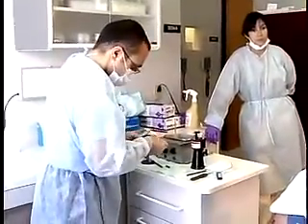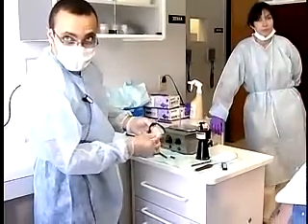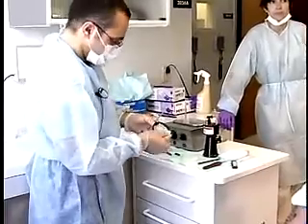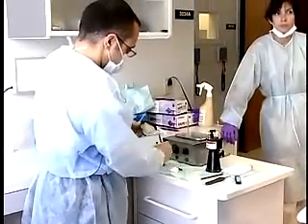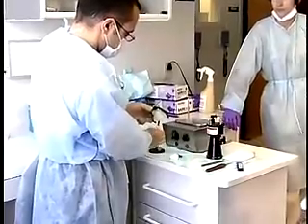Now, add green stick compound to the tissue surface of the posterior border of the final impression tray. The compound should be approximately 4 mm wide and 2 mm thick.